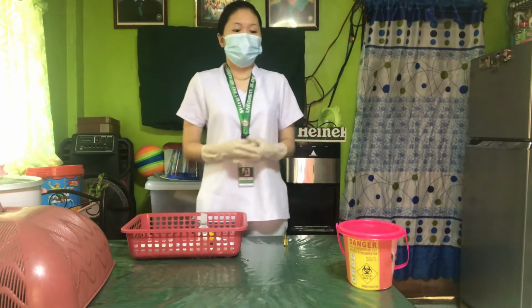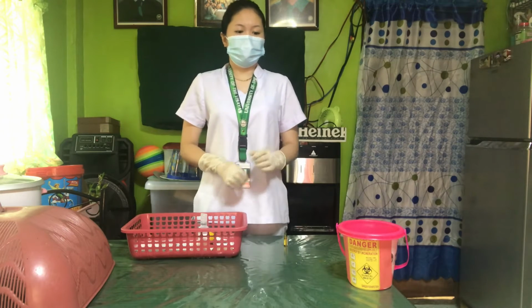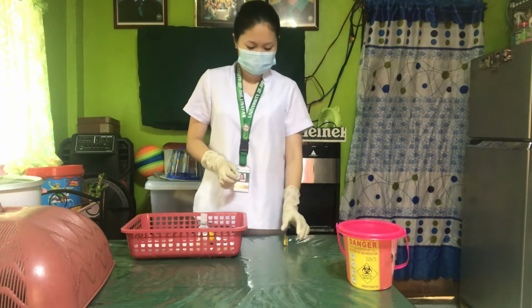Next is flick the upper stem of the ampule several times with a fingernail. This will take all of the drug down to the ampule's primary section.